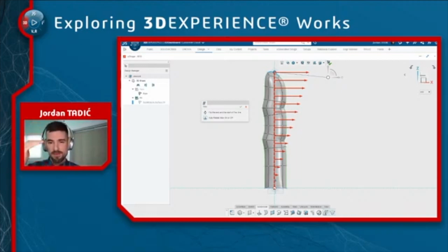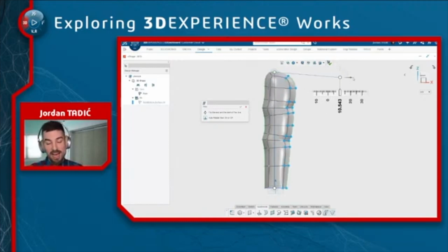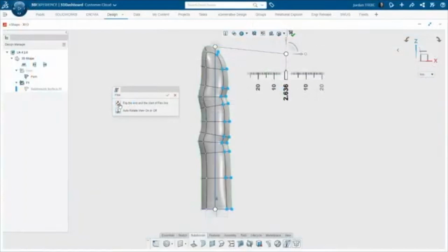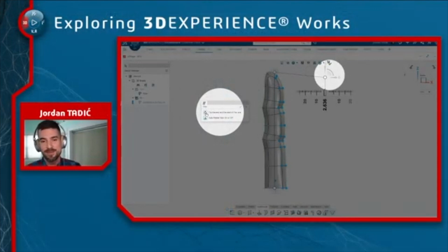And then progressively from the top down to the bottom, the influence is going to get less and less. So it's like a tapered effect. Enough explaining. Let's just see this in action so you can see exactly what I'm talking about. I'm going to select all the entities on the side of this finger, and I'm going to drag the robot, and you can see how it influences up at the top more than the bottom. The bottom kind of stays static, and now we could add that tapered effect. So if I were to name this tool, as much as I like the flex name, I would call it the taper tool, because that's really what we're doing in most cases.